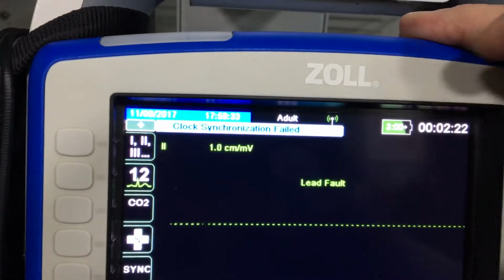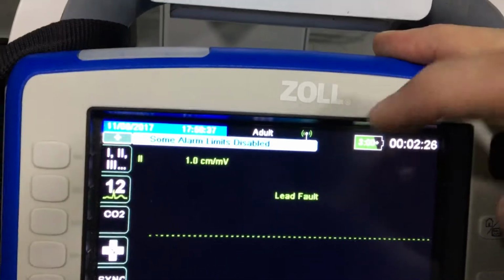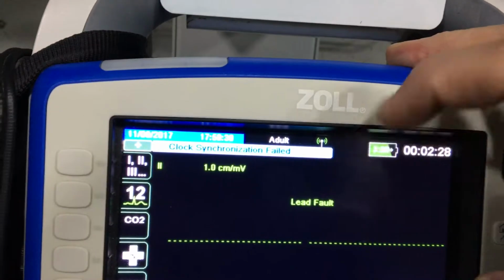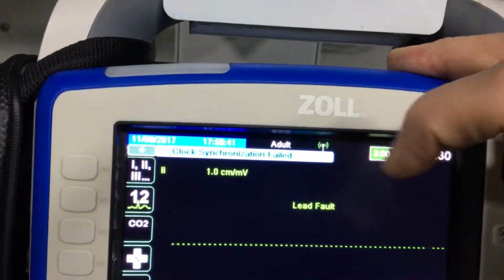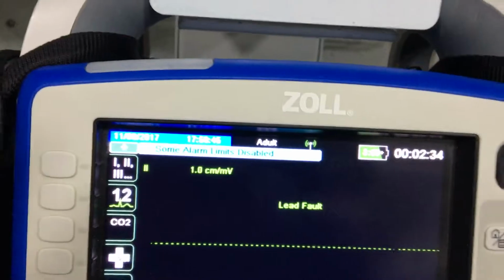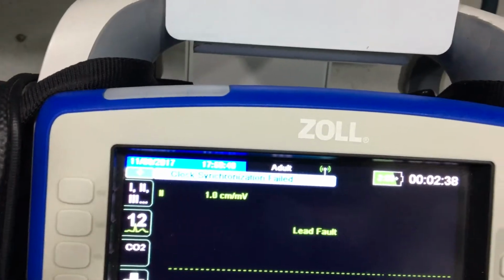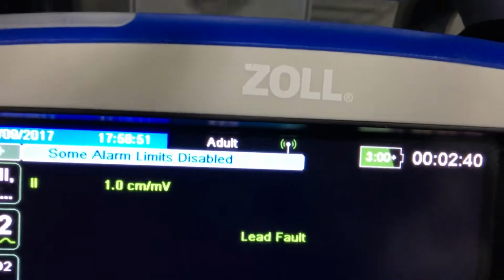that has to be just like that. If it's not connected to the Wi-Fi, it'll have a yellow stars in a circle around that. So again, this takes a minute to connect once you turn it on. It's going to take a few minutes before it connects. Once it does, there you go.